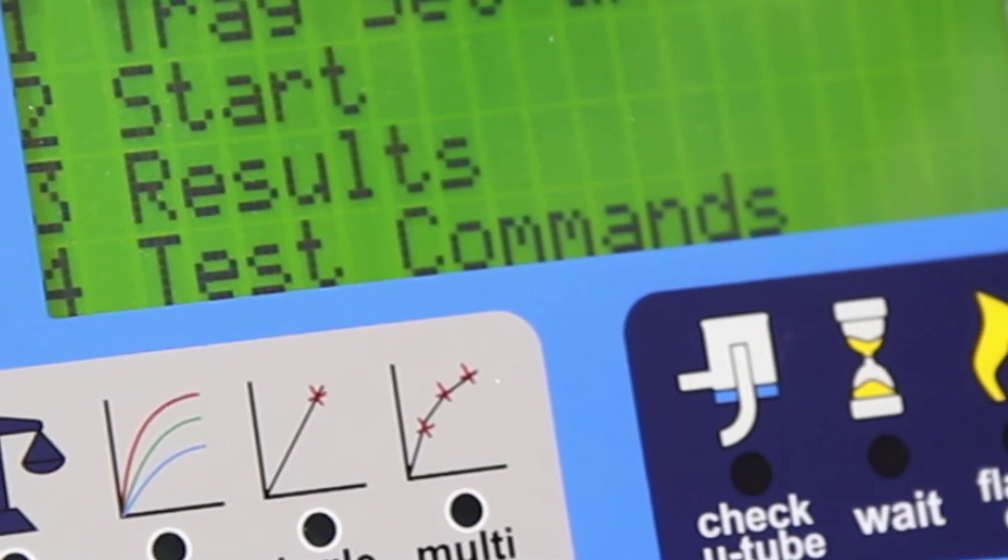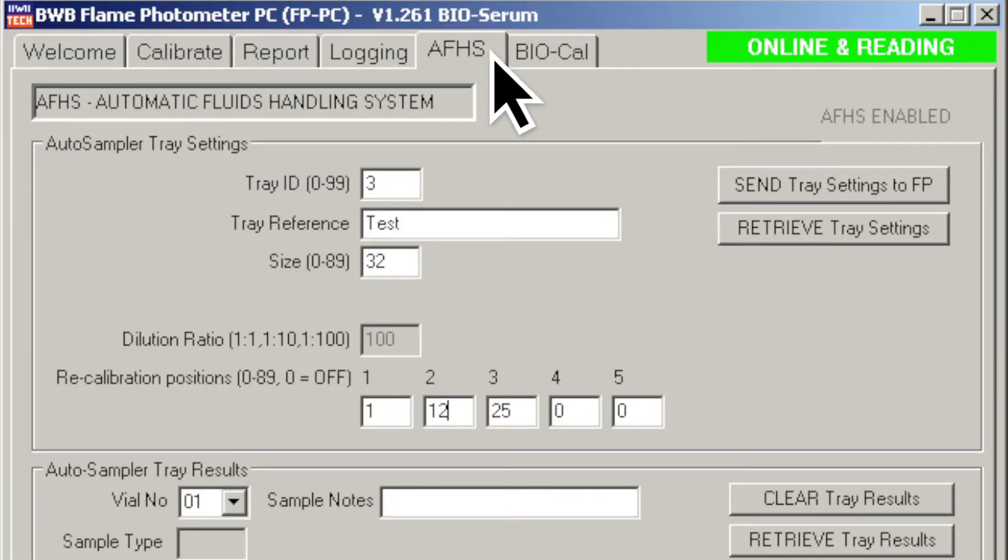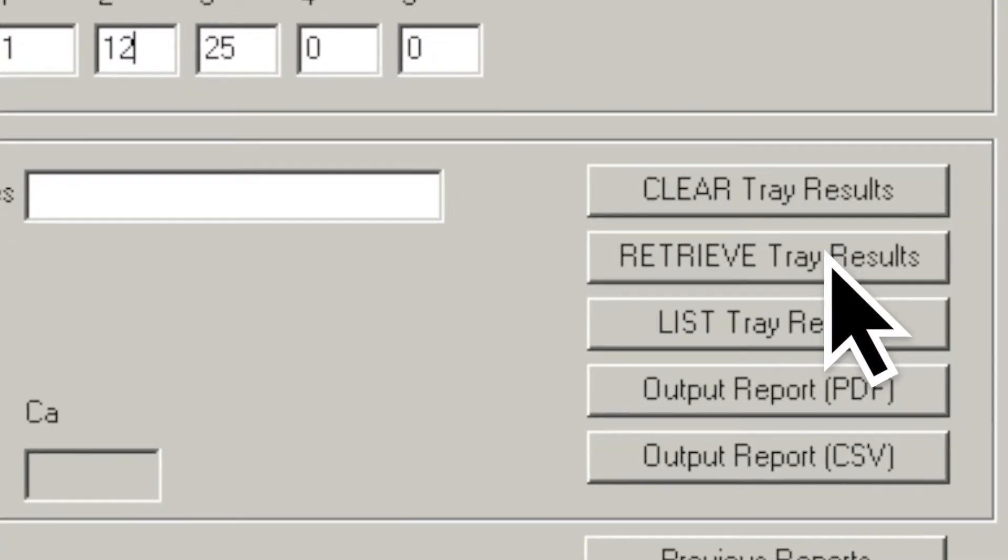When the run has finished, the results can be retrieved via Results, printed again, or uploaded to FPPC software via AFHS tab Retrieve.